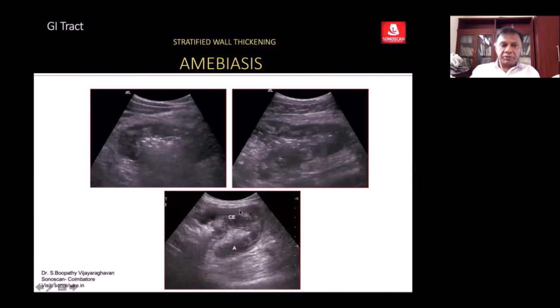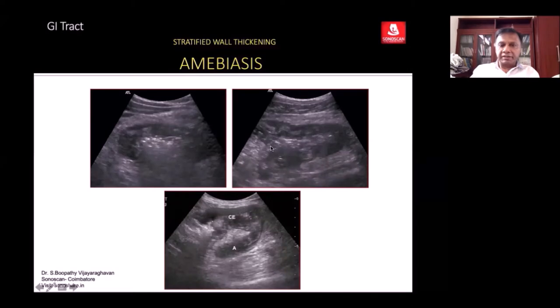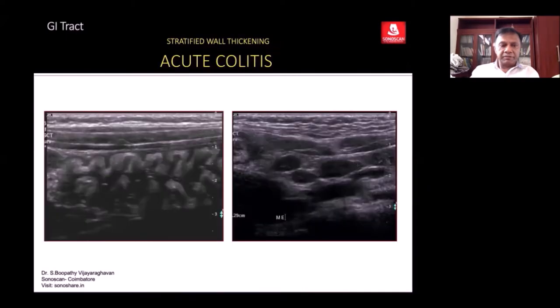In a patient presenting with fever and diarrhea, in the right iliac fossa you see stratified wall thickening. In the long axis you see the cecum — the blind-ending cecum — with layers still visible, similar to stratified wall thickening.